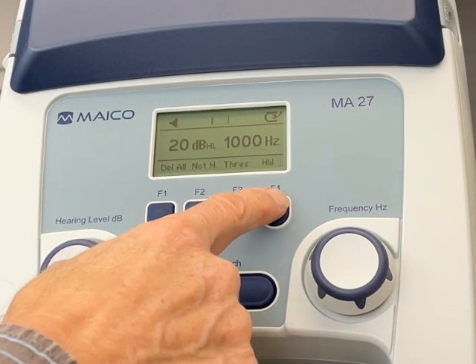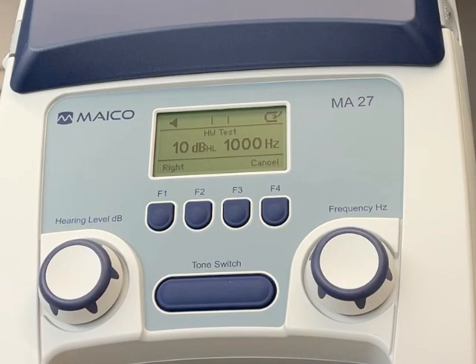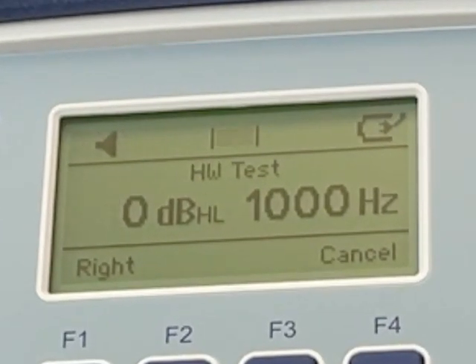When they are ready, press F4 on the audiometer. The test will start automatically. You will see frequencies and hearing levels, as well as all the tone and switch actions on the audiometer display.